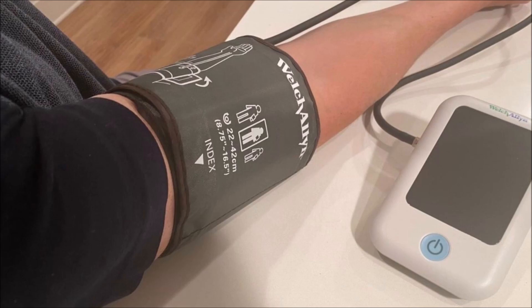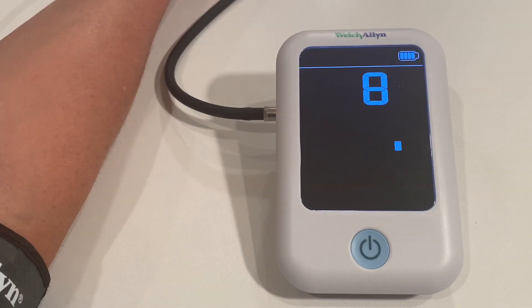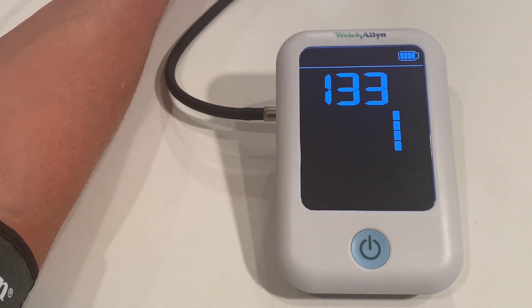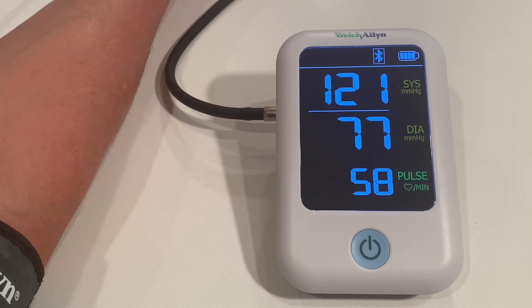My first measurement was wearing a short sleeve shirt with the cuff around my bare arm. The measurement felt very typical and the result was 121 over 77.